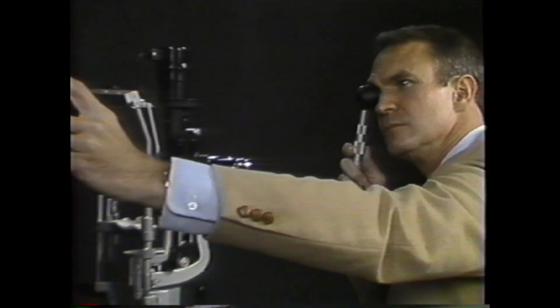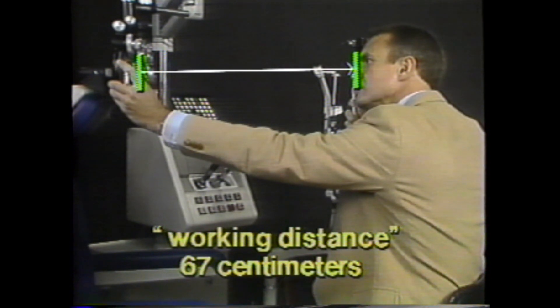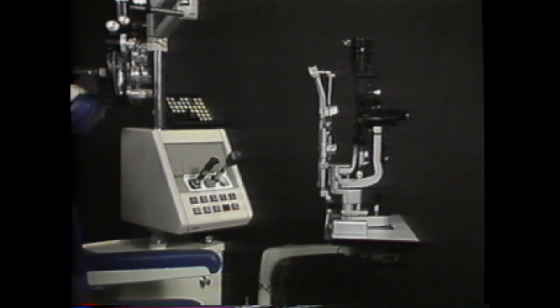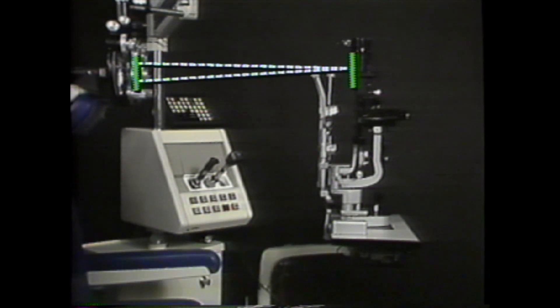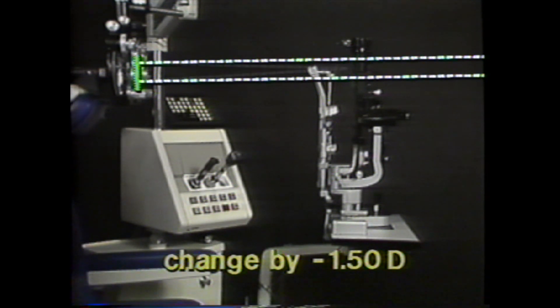During retinoscopy, you will sometimes move forward or backward, but should always finish up at the normal working distance of approximately two-thirds of a meter. When the neutralization procedure is finished, the eye will be focused exactly at the working distance. Then, by changing the spherical portion of the refractive correction by one-and-a-half diopters in the minus direction, the eye's focus is moved out to infinity — practically speaking, to the visual acuity chart on the far wall. So, establishing a constant working distance is important.